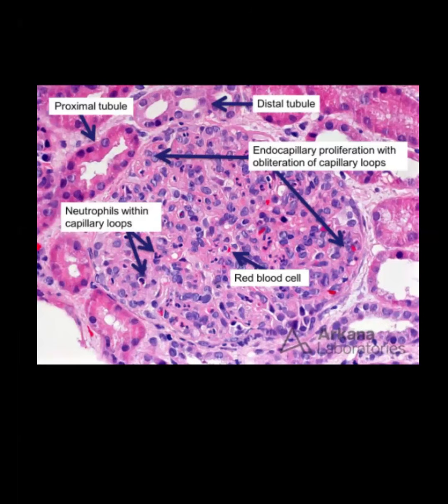Lupus nephritis class 4. Post-streptococcal GN, post-infectious GN, immune complex. And lupus class 2. Yes, class 2.